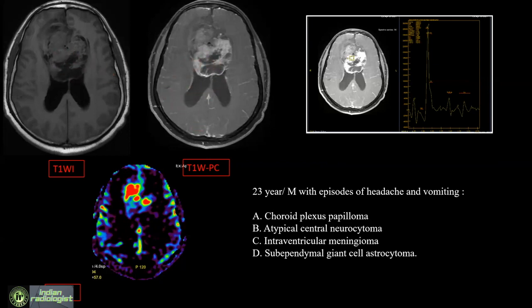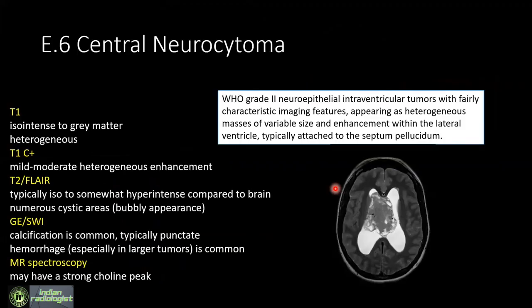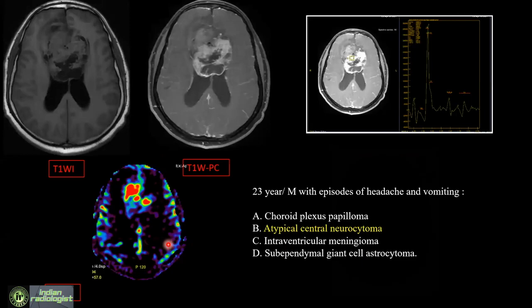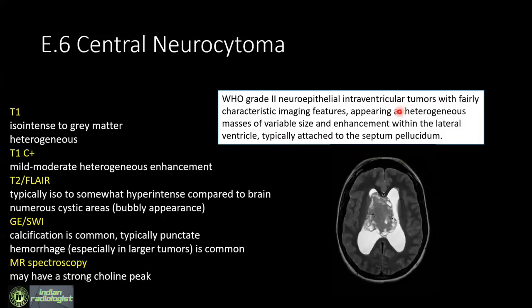Most of you correctly identified this as a typical central neurocytoma. These are WHO grade 2 neuroepithelial intraventricular tumors with fairly characteristic imaging features: heterogeneous appearance, heterogeneous post-contrast enhancement, calcification is common and can be typically punctate. MR spectroscopy shows a tall choline peak as a characteristic feature.